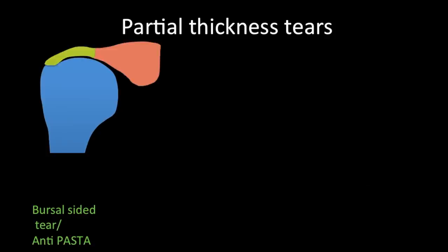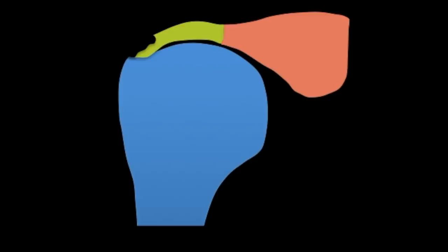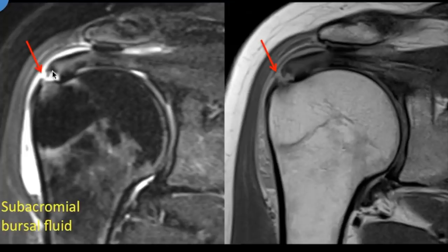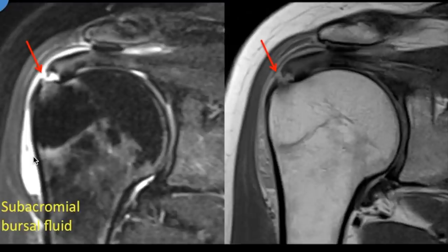Similarly, in bursal sided tears the articular surface is intact. These are sometimes referred to as antipasta. This is an approximately 75% thickness bursal sided tear where the articular fibers are intact to some extent and there is fluid in the adjoining subacromial bursa.